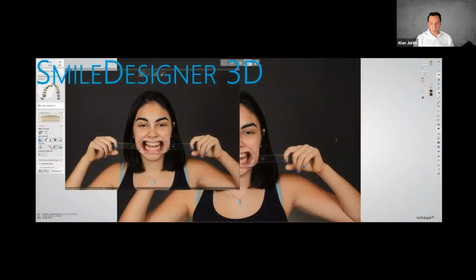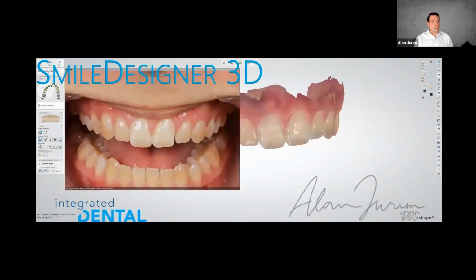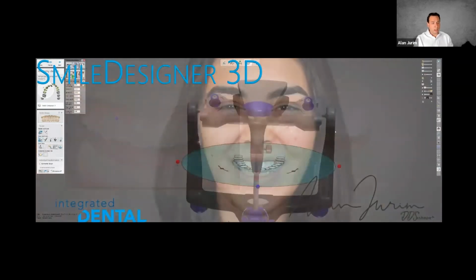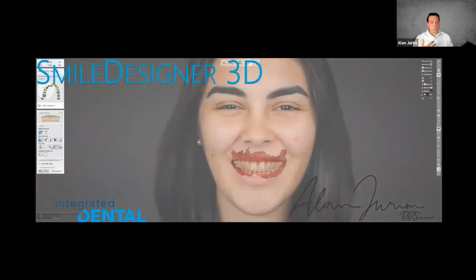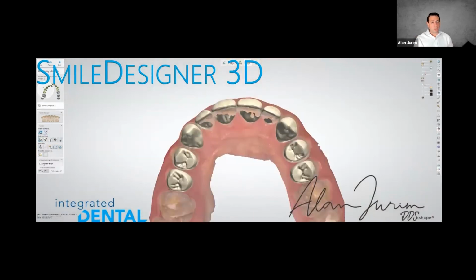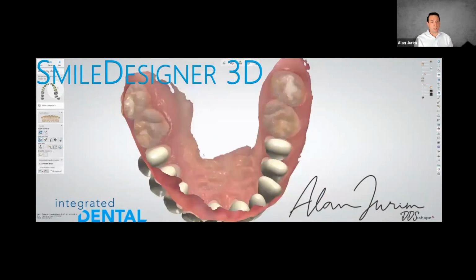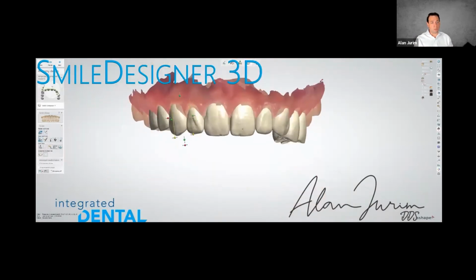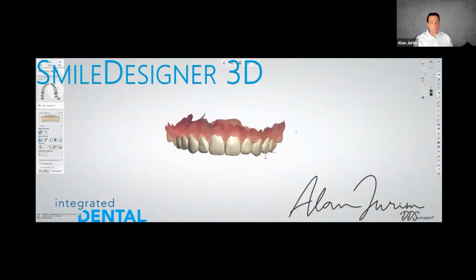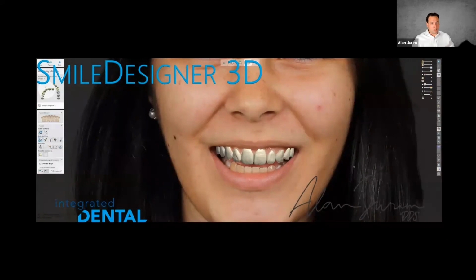So going back to the digital tooth setup again, as we are designing a patient's smile directly in their dental facial profile, like what you see here, the benefit is that we can produce something more customized for the patient directly. We can produce it inexpensively in-house. We can make modifications to it and reproduce it if we need to. But the fact that we can digitally produce it brings a lot of other benefits along with what you see here, the digital design and processing.